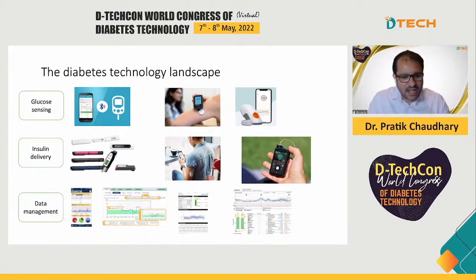And finally, what the connected devices do, whether that's connected blood glucose measurement systems or connected insulin delivery systems, is give us data. And when someone comes into hospital who we don't recognize because they're not our patient, knowing what their background control is, identifying that from the data, can be very valuable in getting better glucose control during their hospital stay.